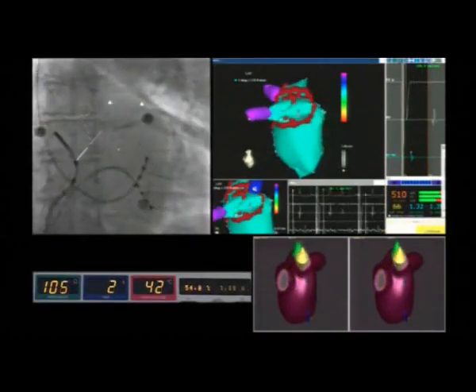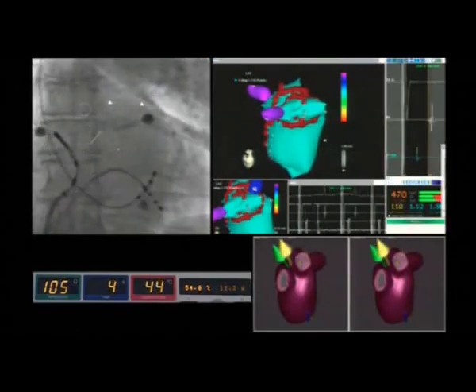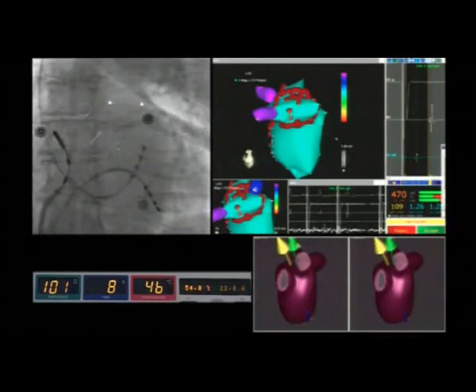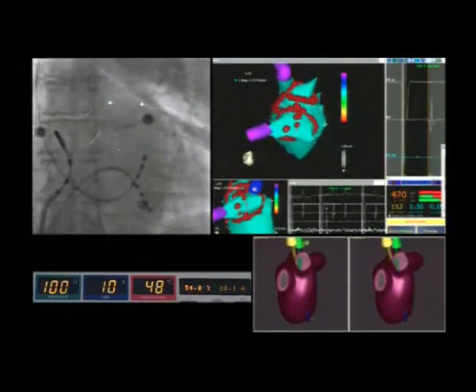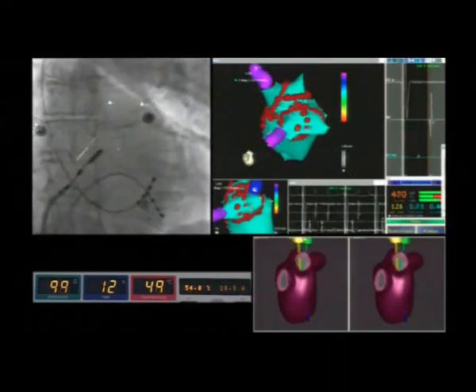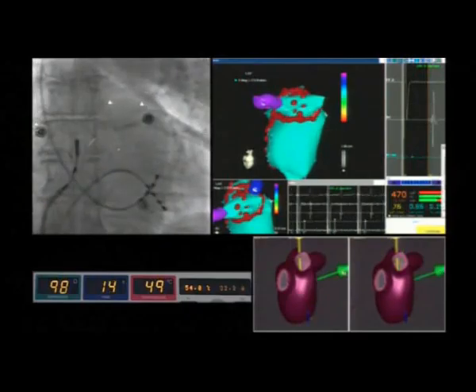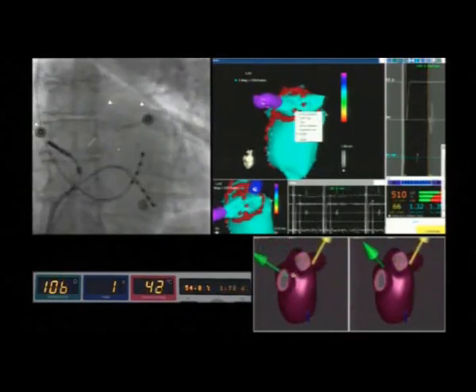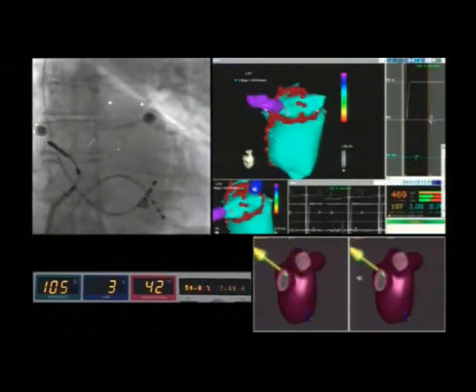During the radiofrequency application in this area, we continuously monitor the impedance values shown in the bottom left panel in the green box. This is done to avoid the delivery of radiofrequency energy near to the pulmonary vein ostia.